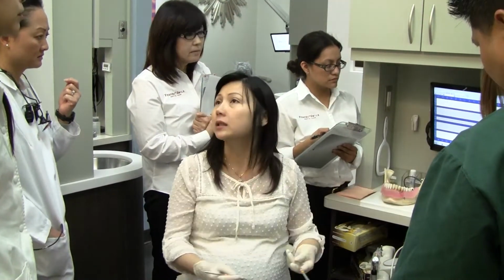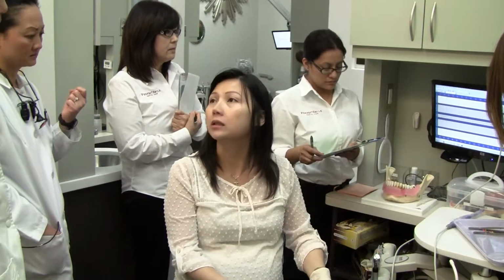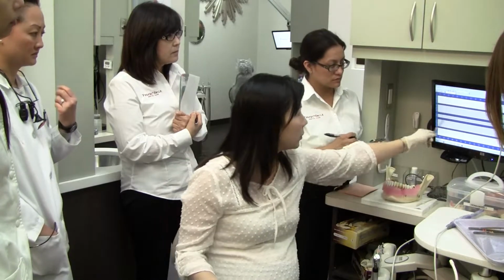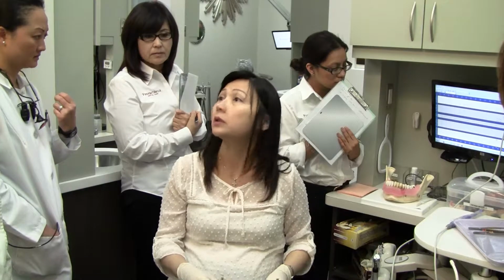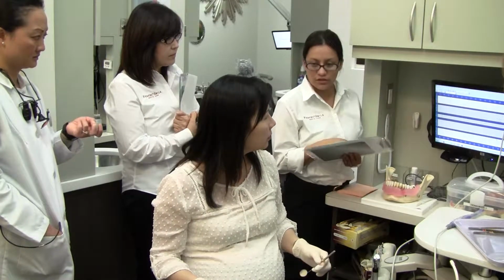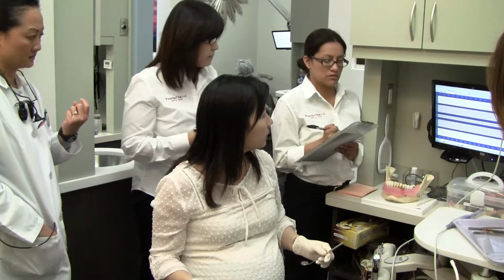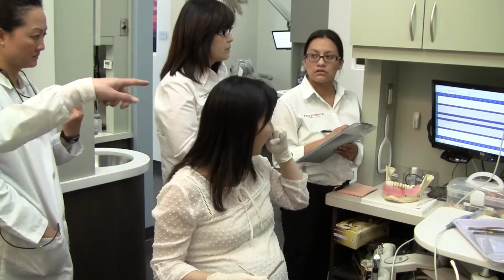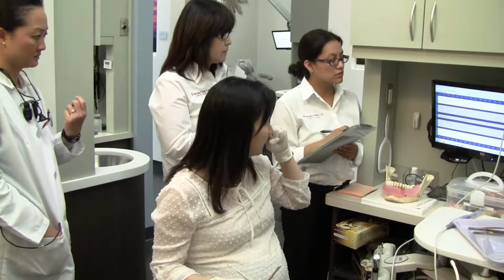If let's say they're missing a tooth, then I'll read out to them, I'm measuring 18, mesial buccal 18 or something. But if it's a standard 3, 14, 19, and 30, then I'll just continue to read the numbers. So it's typically 3, 14, 19, and 30. It's a 3 buccal, and then 14 lingual, and then 19 buccal, and 30 lingual. You catch that?